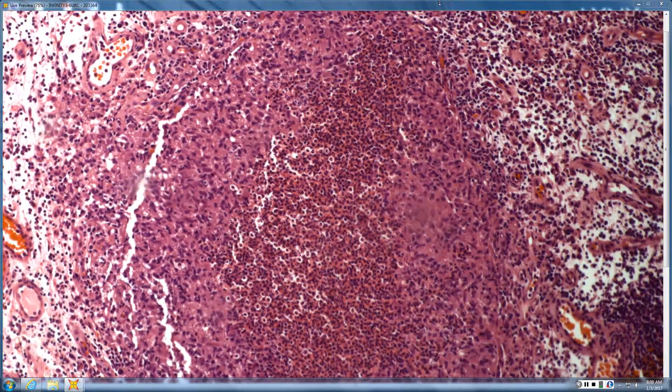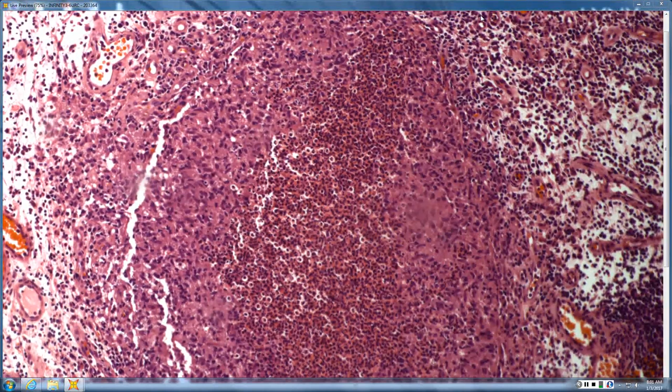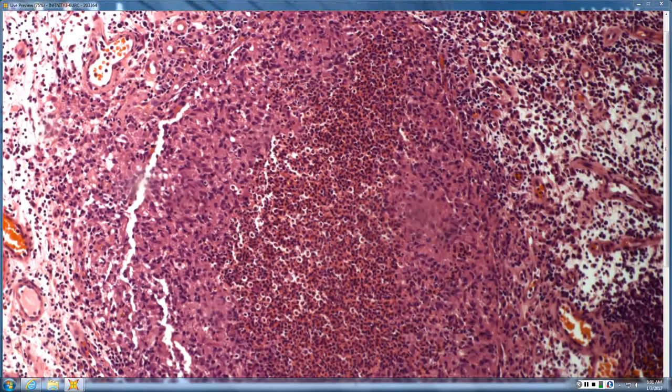That's the sort of thing you could see with Wegener's granulomatosis with angiitis. You could see it with infections: cat scratch, lymphogranuloma venereum, atypical mycobacteria, tularemia, sporotrichosis. When it's associated with a follicle, it's just suppurative and granulomatous folliculitis. And when it is associated with follicles on the eyelid, then we call it a hordeolum if acute, and chronic granulomatous is chalazion.